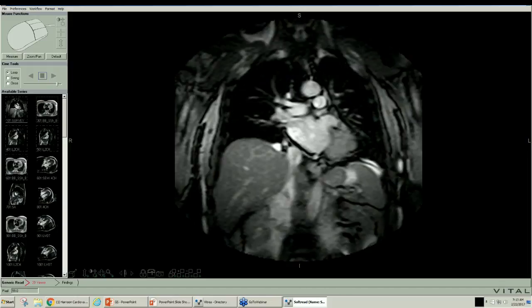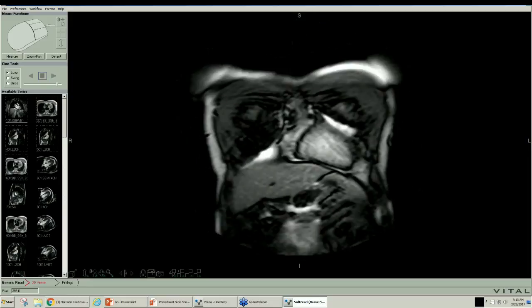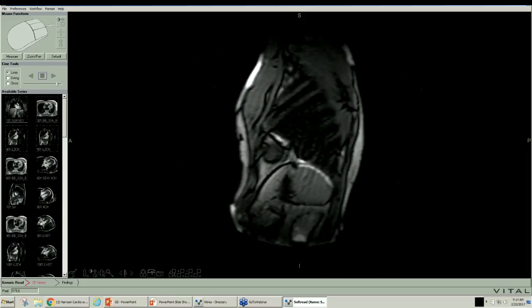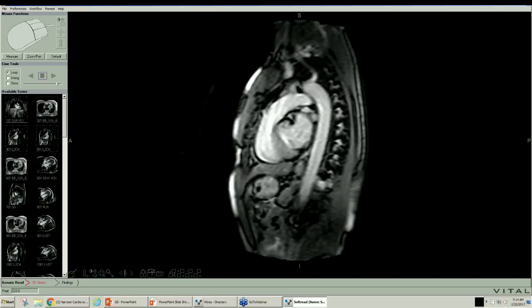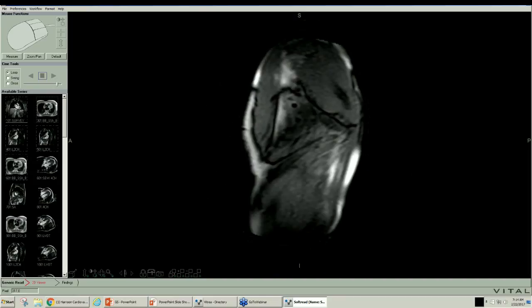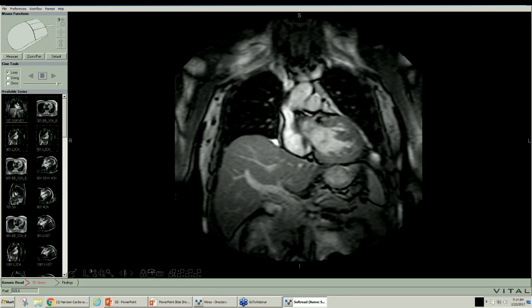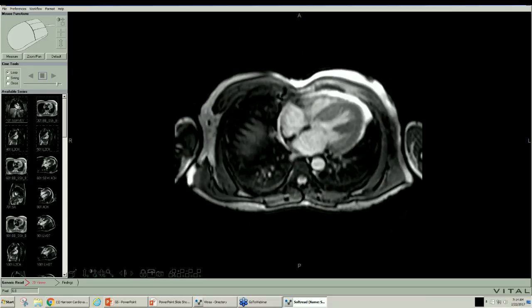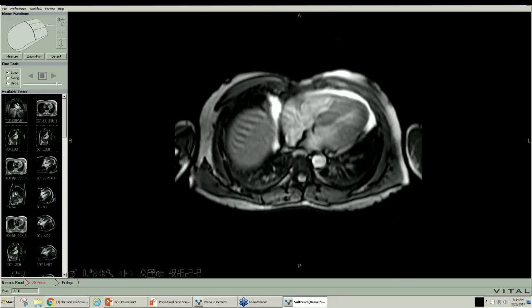So we can see the heart location is here. Left atrium does look a little enlarged. This is really not done for anatomy, although the left ventricle looks very thickened and we can make out stuff. You know, there's normal breathing taking place during this, and so there's motion artifact. There's no attempt to gate. But the left ventricle does look thick. Right side is chamber size normal. And sometimes we can see other things like eventration of the diaphragm, paralyzed diaphragm. So we look at everything in terms of the anatomy. You see the muscular definition.